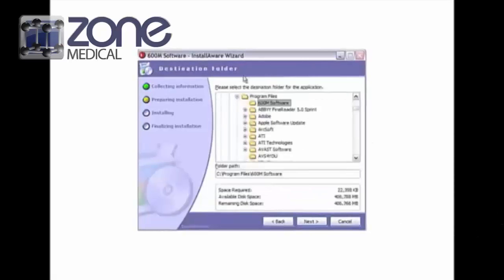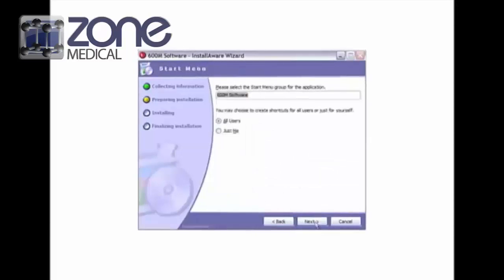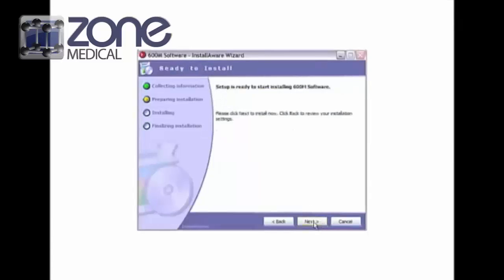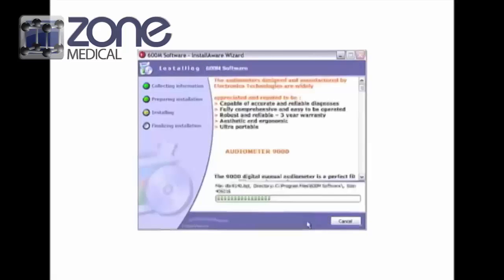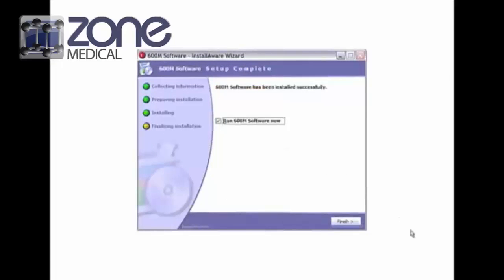Here you can choose where you would like the software to be placed. Click next, then choose what you wish the software to be called. After this, click install. The download will only take a couple of minutes. Once it's downloaded, you can choose to run the software.